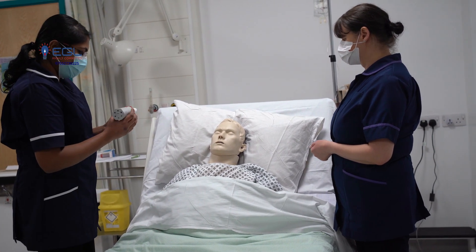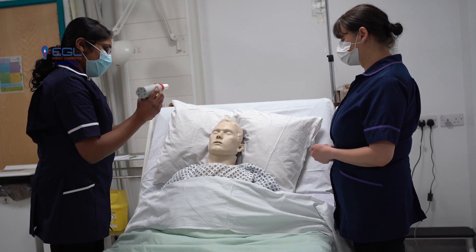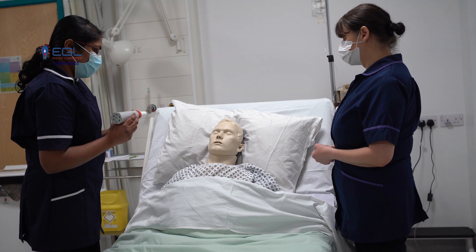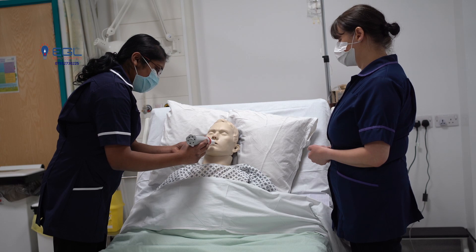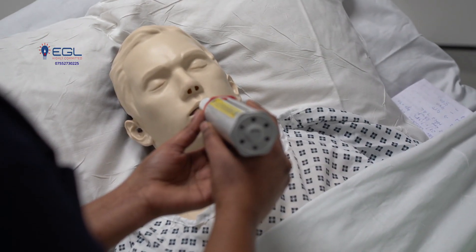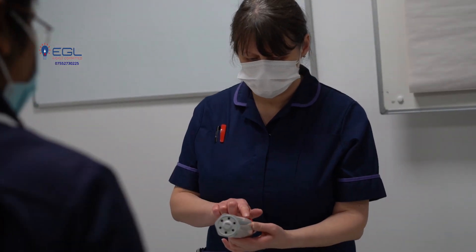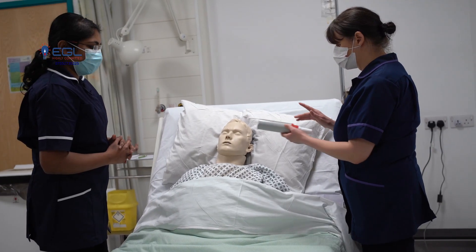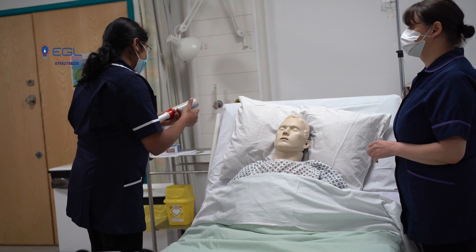Peter, this is your third reading. Are you ready? Yes. You can take a deep breath through your mouth and hold it for no longer than 2 seconds. Seal your mouth around the mouthpiece. You can blow forcefully into the meter. Your third reading is 460.